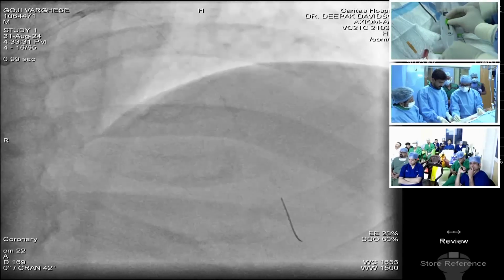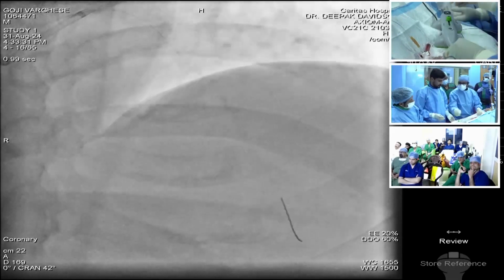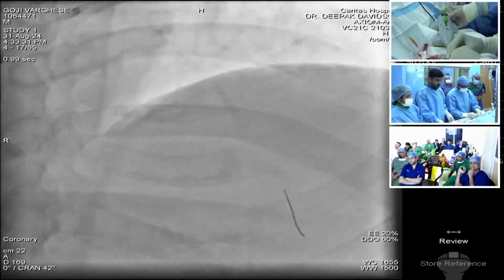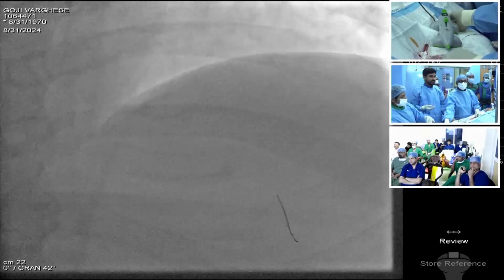So that's actually in lock position. We'll go inside. We'll open this. Both can be done. It usually moves in very freely.